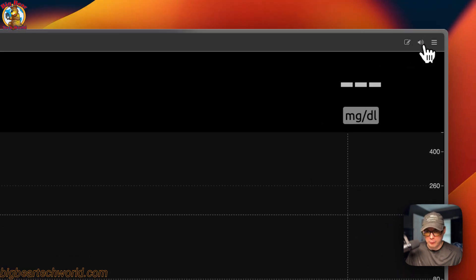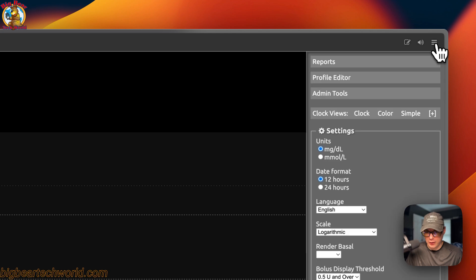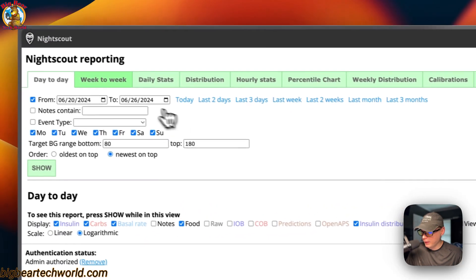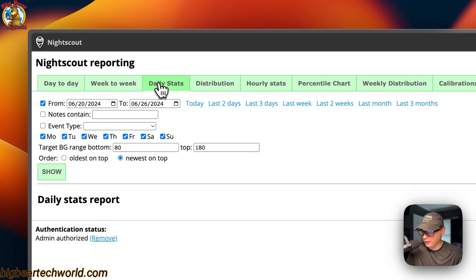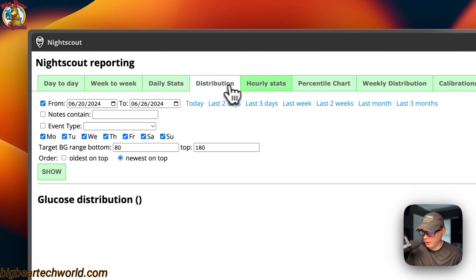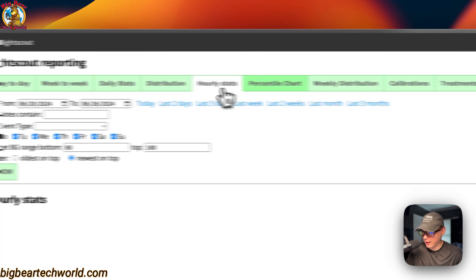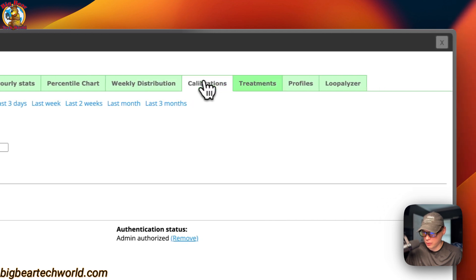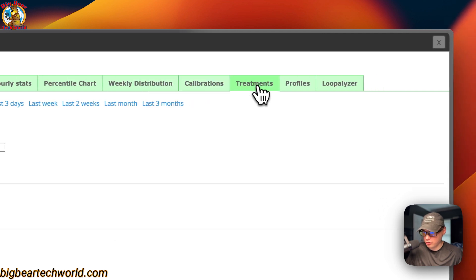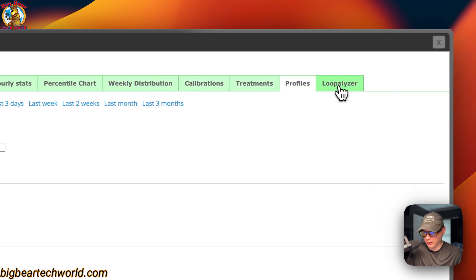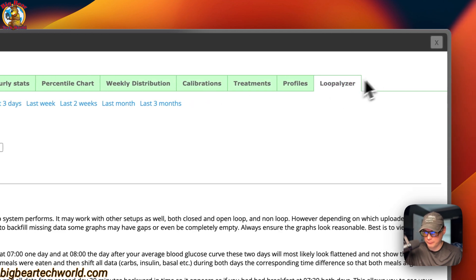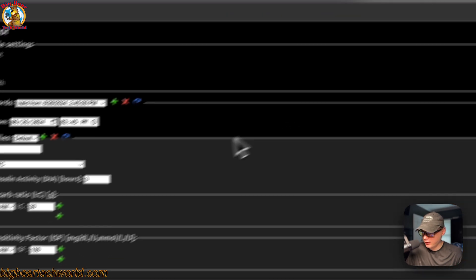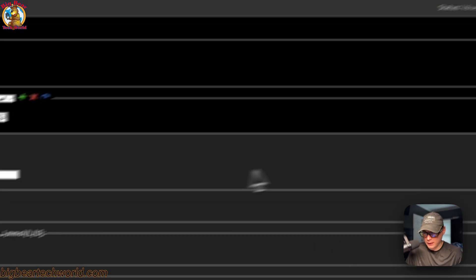From the home screen you can turn on music. Going to the Reports section, you can see week-to-week stats, daily stats, distribution, hourly stats, percentile chart, weekly distribution, calibrations, treatments, profiles, and the Loopalyzer. You can also return to the Profile Editor from there.